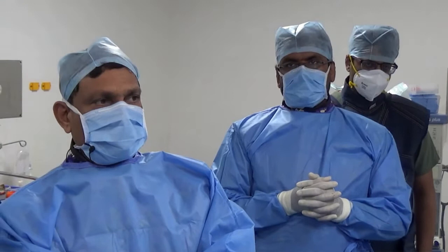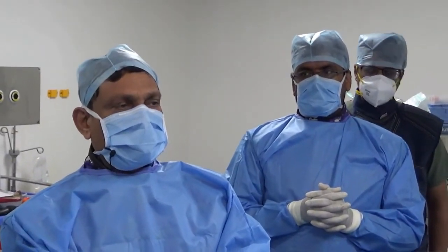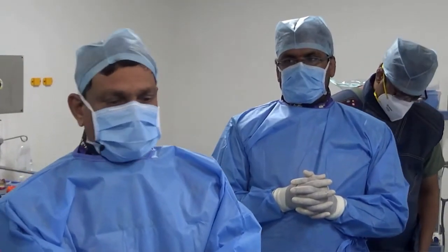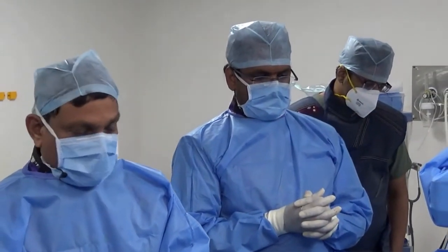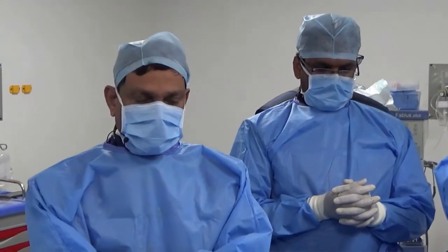That part I don't know, but whenever there is, as you said, a distal fistula with an ectatic segment, I have also noticed in some of the published literature, as well as people, Shack also presented one of the cases, that developed thrombus. I do agree, I will take that point and definitely will keep the child on oral anticoagulants.